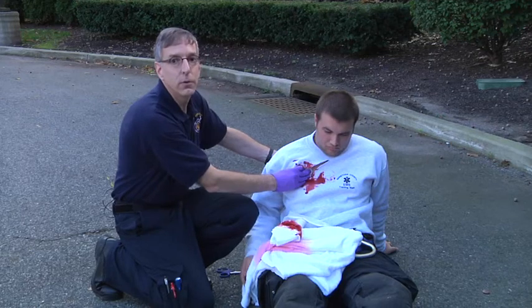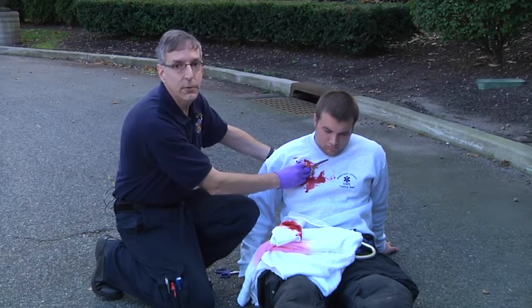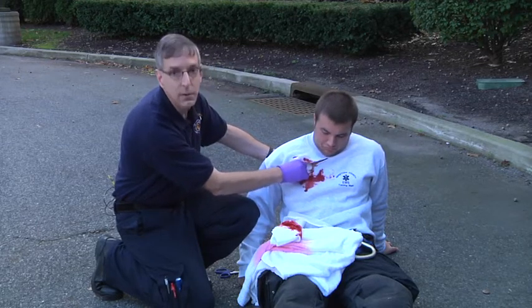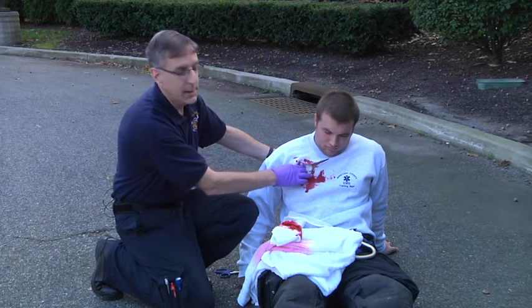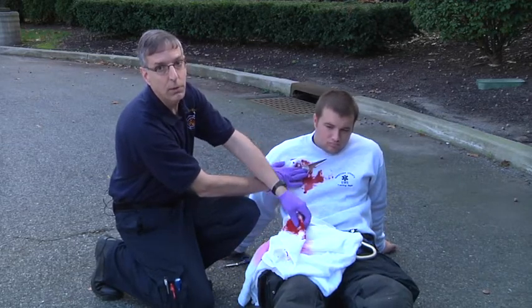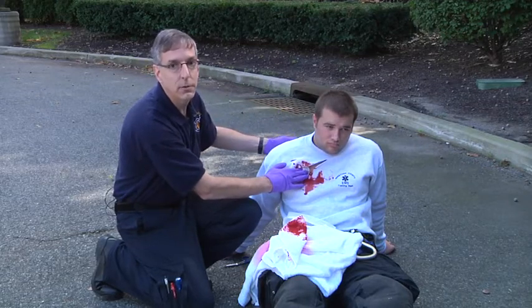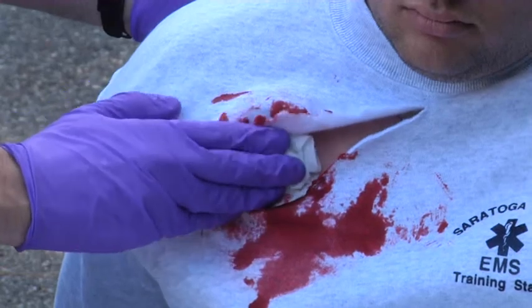A couple of critical things with using Combat Gauze. One is, if the gauze itself is actually not touching the source of bleeding as we packed it into the wound here, you're not going to actually control the bleeding. So it's necessary not to lay the gauze over the wound, but to remove whatever the patient had been holding on the wound previously and pack the Combat Gauze directly into the wound so that it's contacting the wound surface.